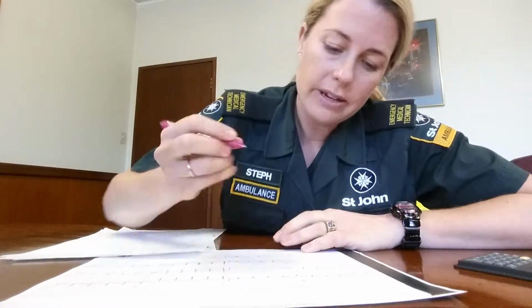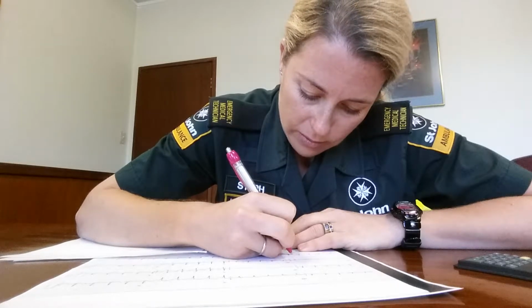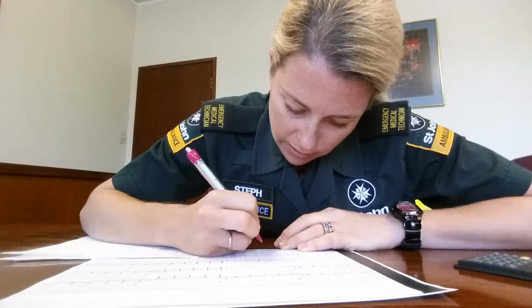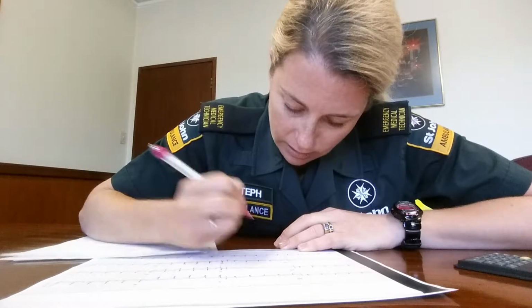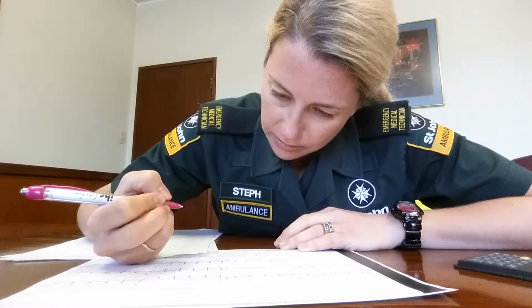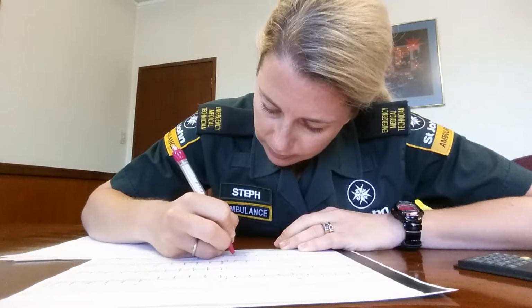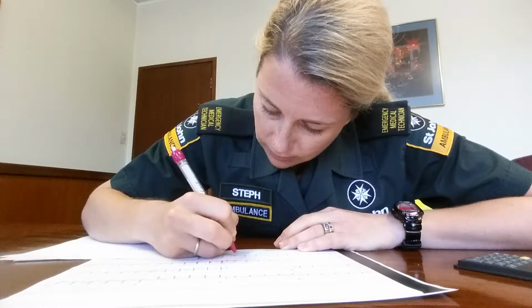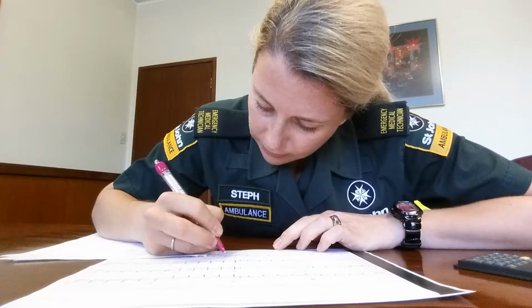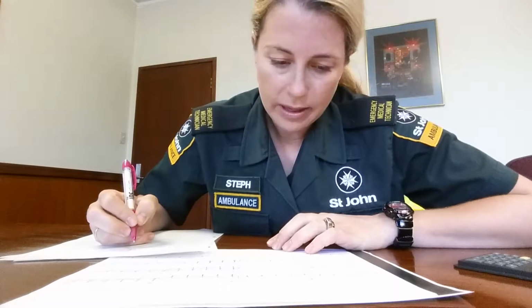Then we're looking for our PR interval, which should be between 0.12 seconds and 0.20 seconds, and regular, which they are, constant at about 0.20 seconds, so they are not prolonged. No heart block there.